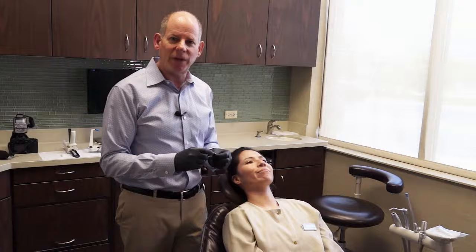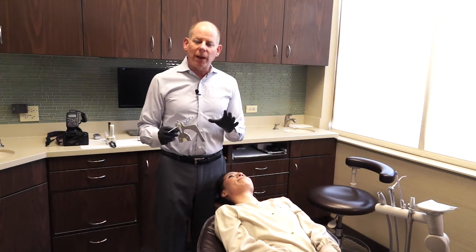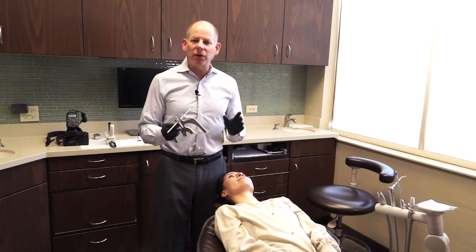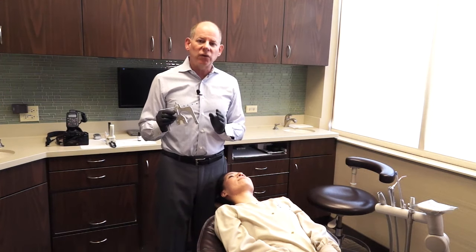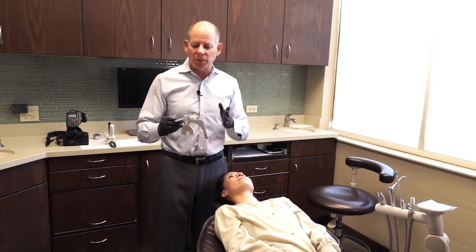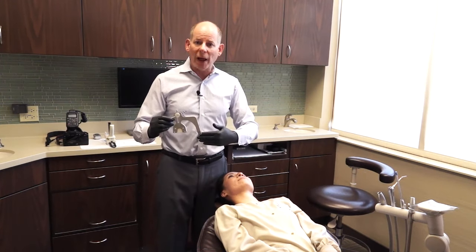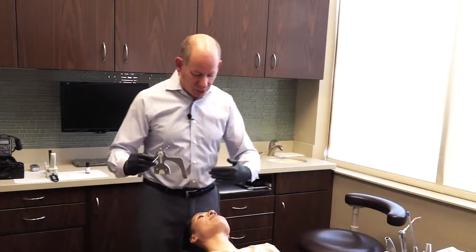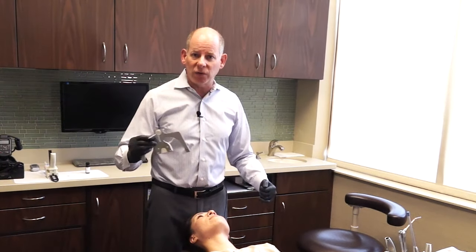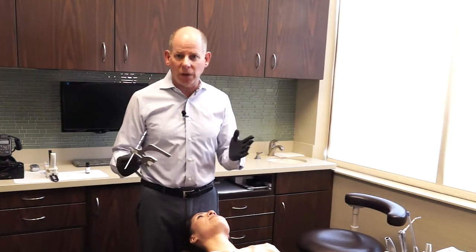With the Coise facial analyzer, everything is done at once. I use a rod to check alignment down the midline of the patient's face and use the floor as my horizon, so the patient needs to be lying at about 180 degrees. Sometimes I have the patient tip their chin up so I can look straight down their face. I practice the positioning first so I understand exactly how I want it positioned before I take the Coise facial analyzer.